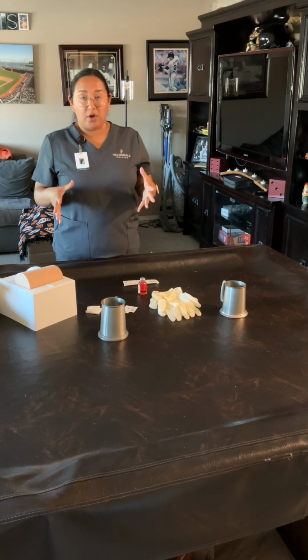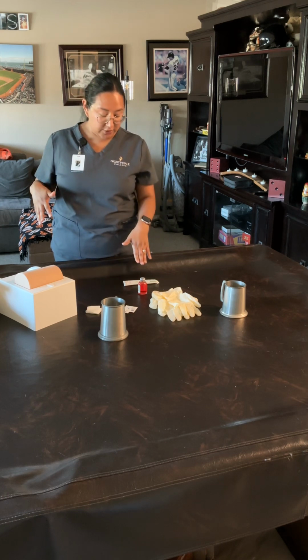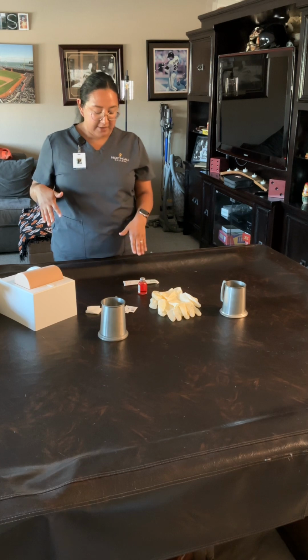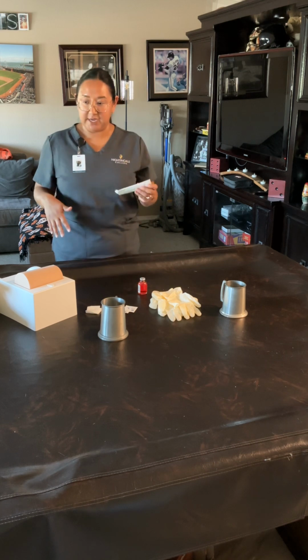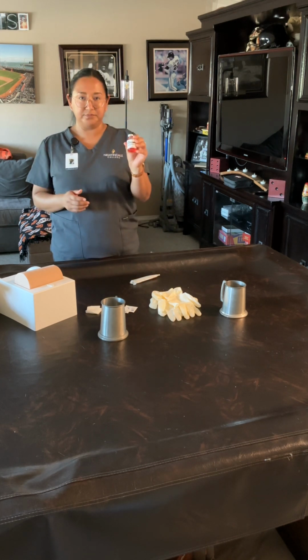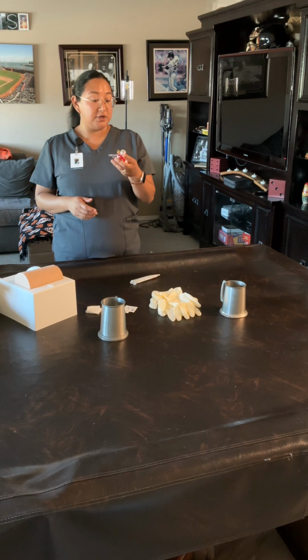So now that I've gathered all my supplies and my patient, I'll make sure that I have my needle here. It's a 25 gauge by 5/8 inch, and a 1 milliliter syringe. So I have this right here. And then my vial of heparin, it is about 10,000 units with 10 milliliters.